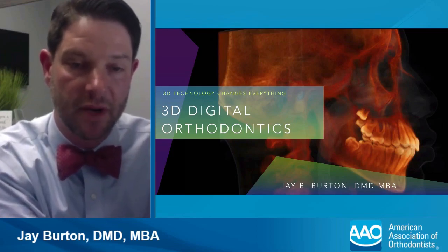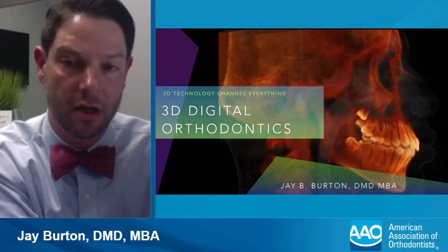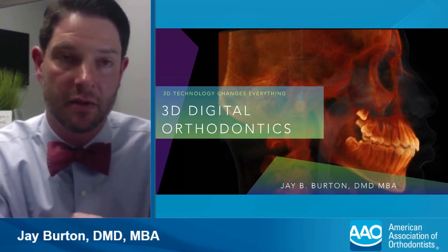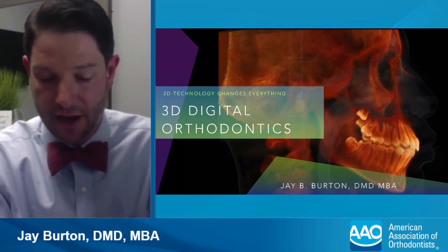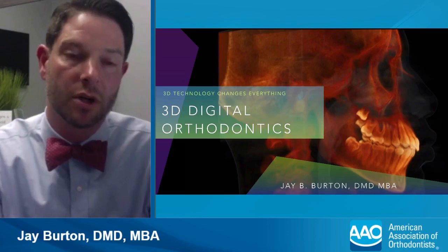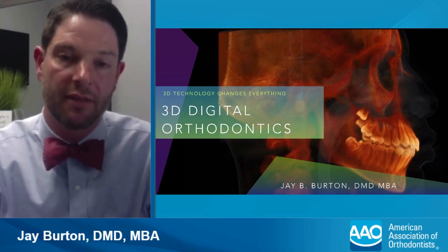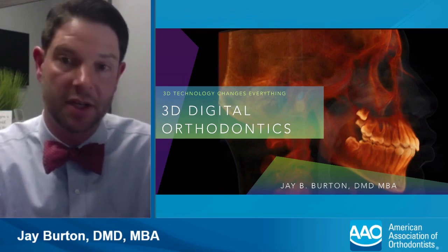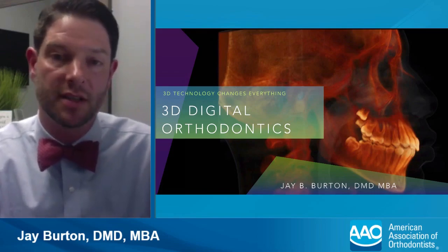The reason I had the paper from Ludlow and Koivisto, or the poster, was because at the end of that was the statement that they were able to maintain diagnostic image quality while reducing radiation dose. If you look at some of the research Ludlow has also done on other machines that are out there, you don't see the same statement.